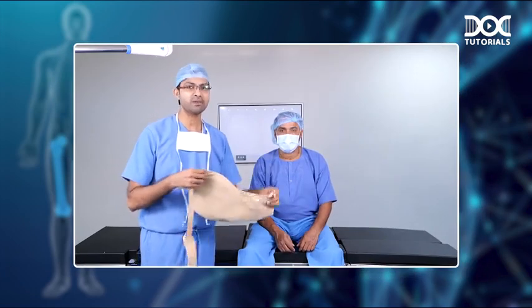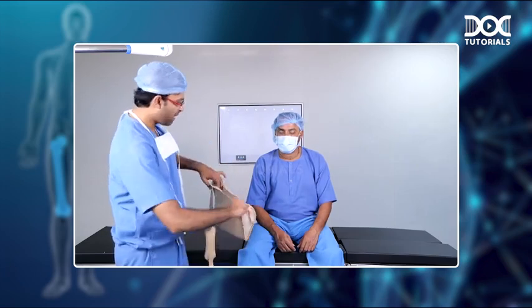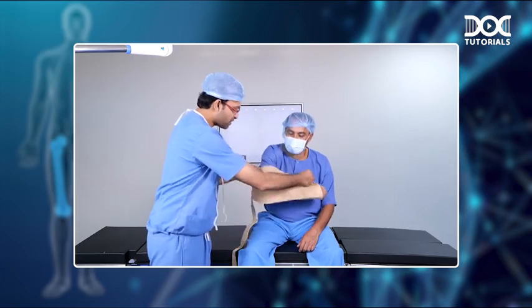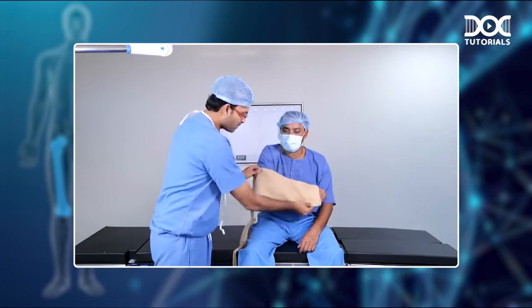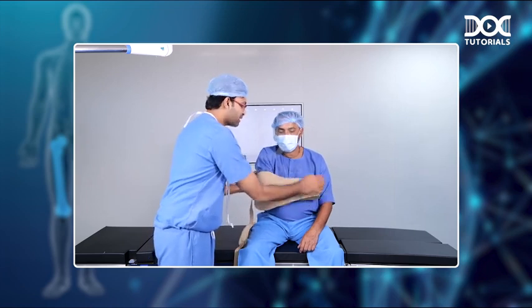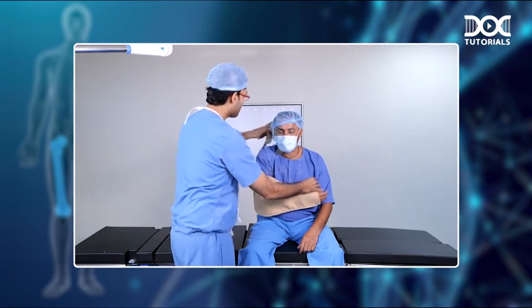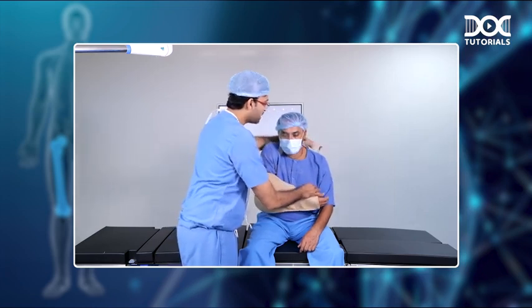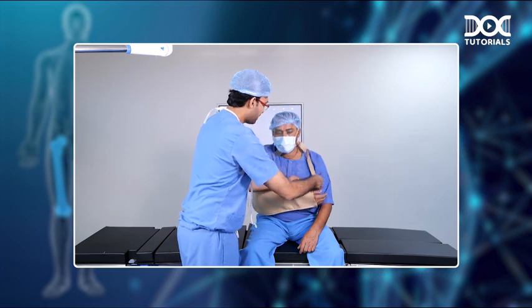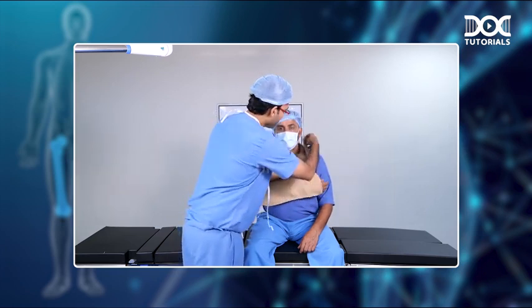This is a very simple device. You open the arm pouch like this and ask the patient to slip the forearm inside. Make sure the elbow of the patient comes in contact with the corner of the pouch like this. Then only the splint will fit well. Once you do that, you take the strap that you see here around the neck like this. Then you wind it around and fix it on the top.